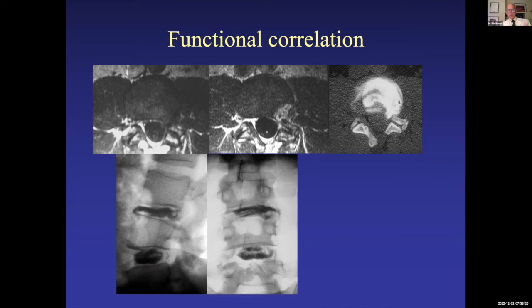As I was injecting contrast in the disc, the patient said nothing. When I saw under fluoro that the contrast went toward the left, the patient said, that's my typical pain. And we did a post-discogram CT showing that the contrast actually extended through the annulus into the area of enhancement on the pre-discogram contrast-enhanced MR. So this was all concordant with where the patient's pain was generated, and they were confident that that was the pain generated.